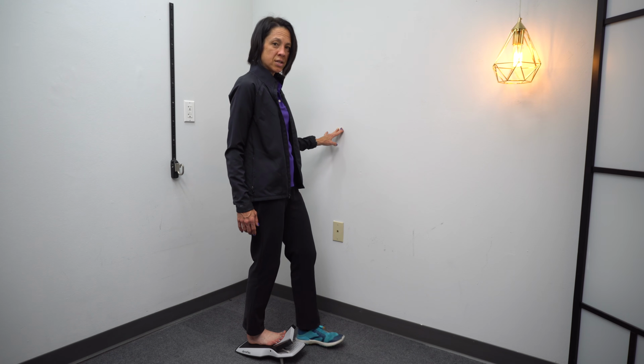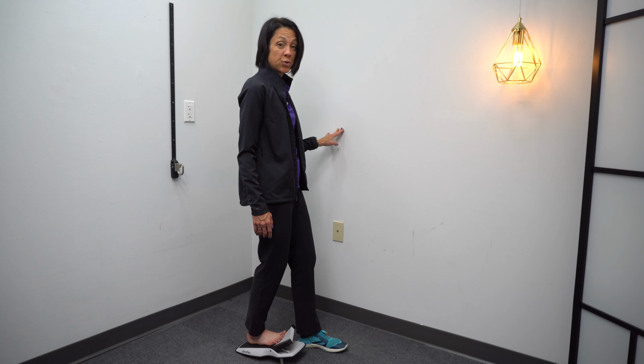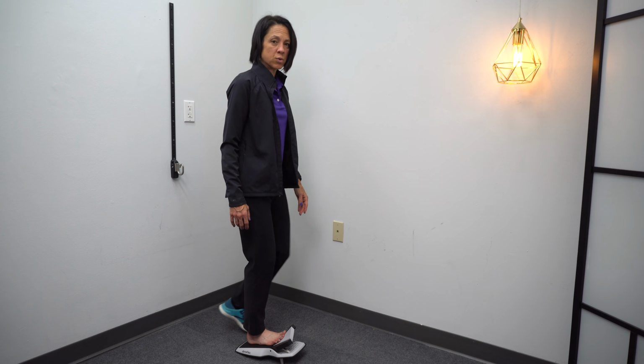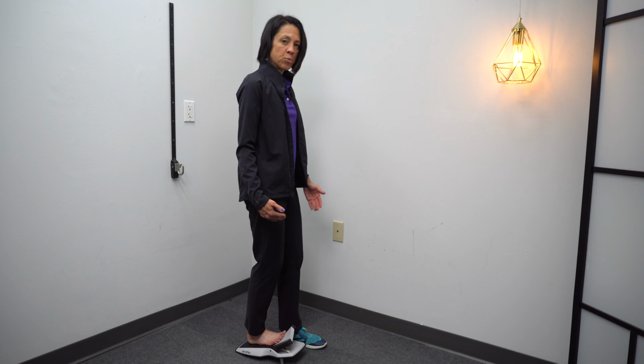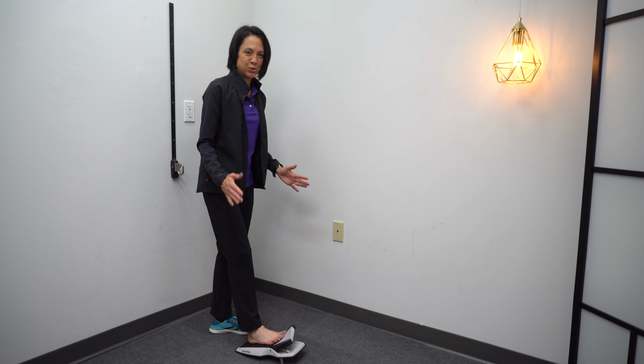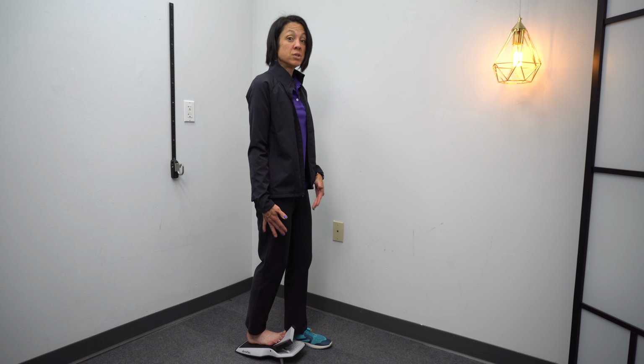And then if you wanted to add some loading without those toes curling, which we're going to go into in the next section, you can add a little forward-backward step. However, before you get to this, I do recommend that you do the loading progression that we're going to do next, but that is another way to use this tool.